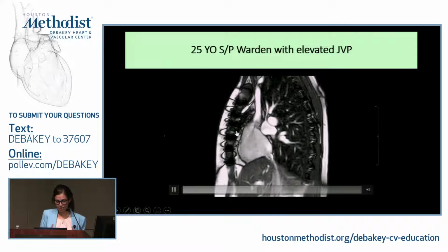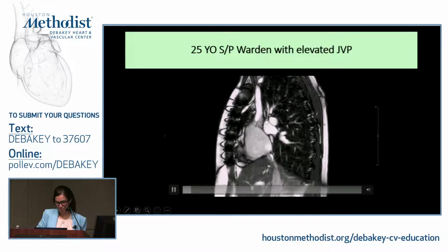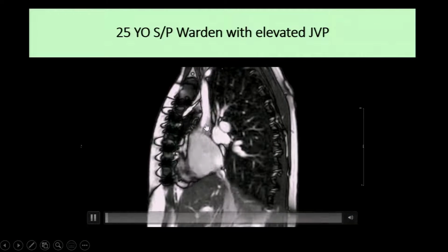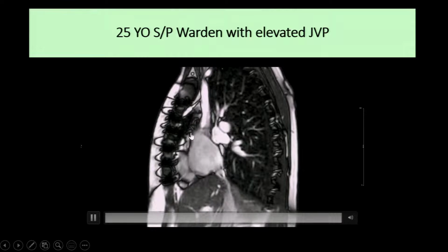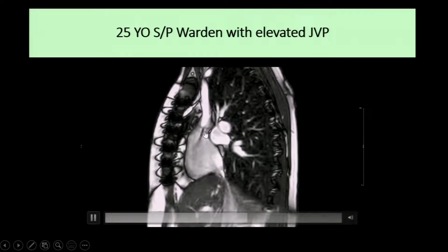The right ventricle had significantly reverse remodeled. So in imaging, you can see this is an MRI. This is close to a bicaval view in a post-surgical anatomy. This is the SVC, and this is the anastomosis site. This was the right atrial appendage, and you can see flow acceleration here.